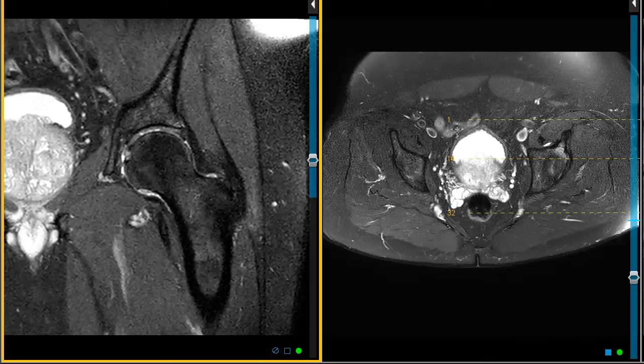Hello, this is Dr. Gay from First Look MRI. This is a 71-year-old gentleman who fell one month ago onto his left hip.